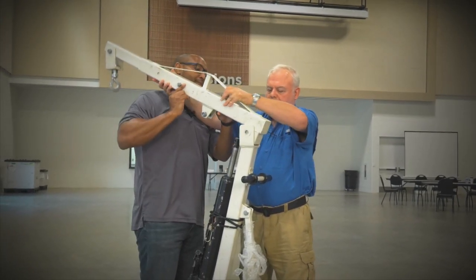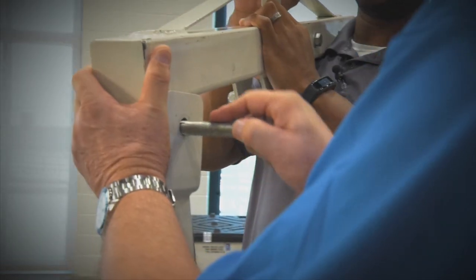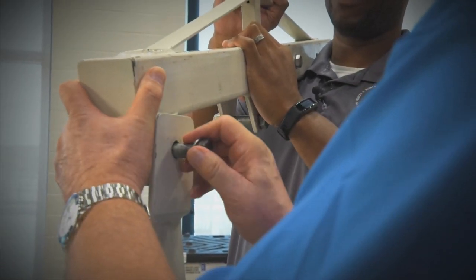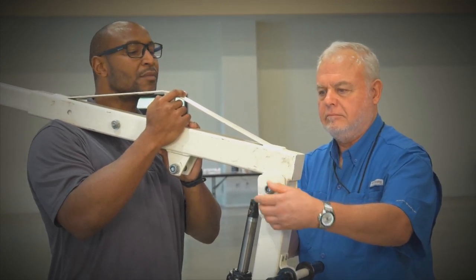Using one bolt, attach the extension arm to the top of the center support beam. This process will take at least two people. The extension arm is heavy and must be held in place while tightening the bolt.